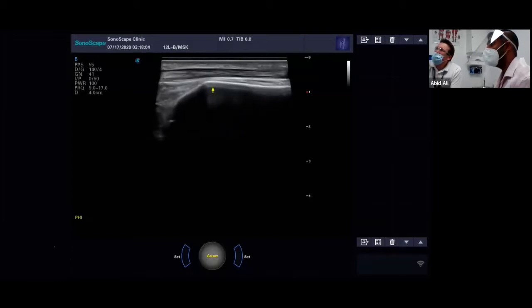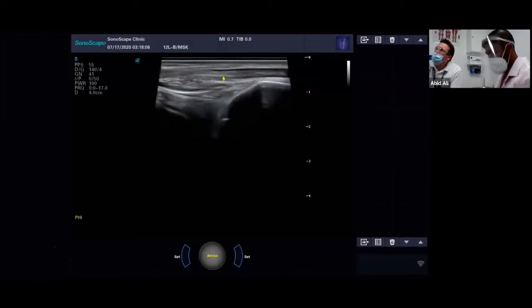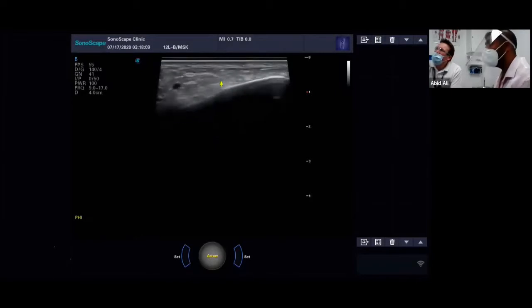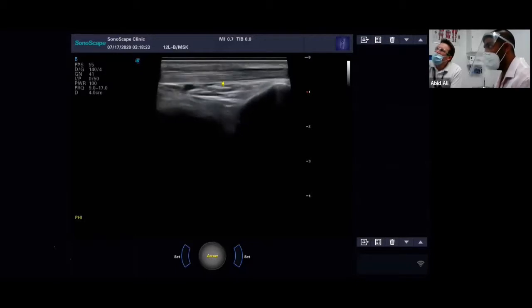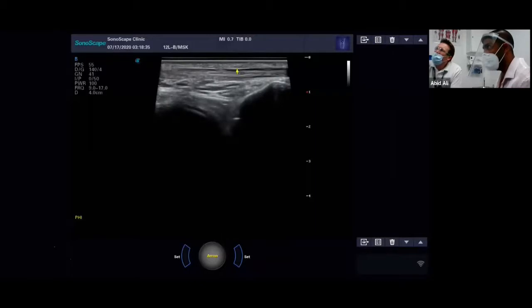And as you can see, we can see the extensor. Let's stay on the Tibialis Anterior for a second. And if I carefully hold my probe in this position, I can ask Adrian to move his ankle up and down, dorsiflexion, plantarflexion, and you can actually see the movement in the tendon. You can also see the separation between the tendon and the paratenon. And you can see the nice stripy fibres. Do you want to make out the paratenon for these guys, please, Adrian? So this sort of dark halo around the tendon.